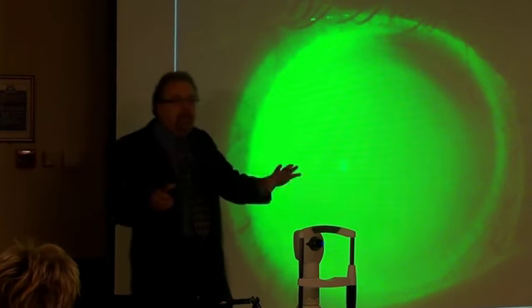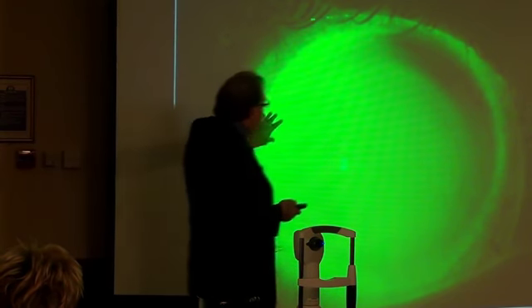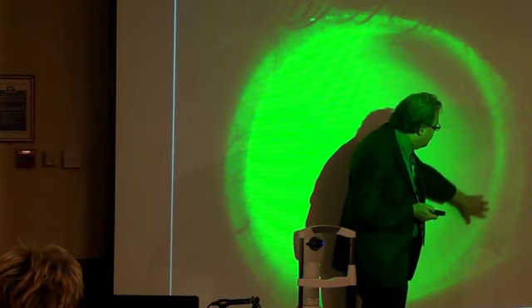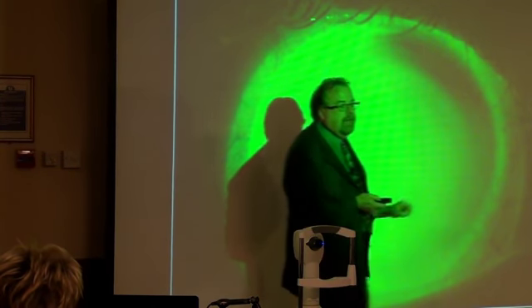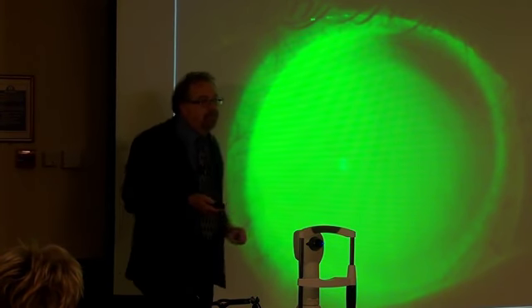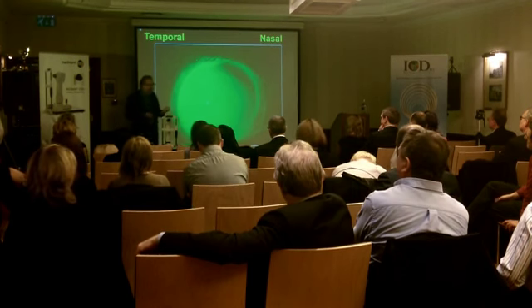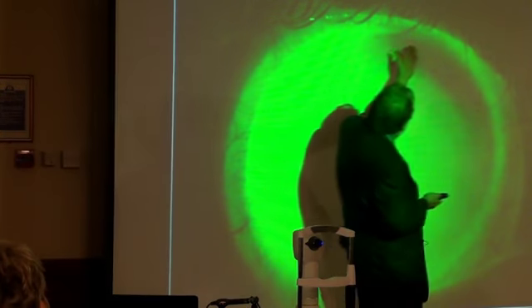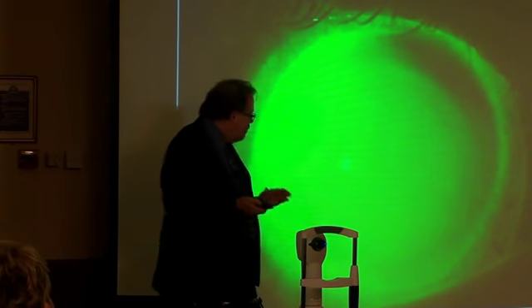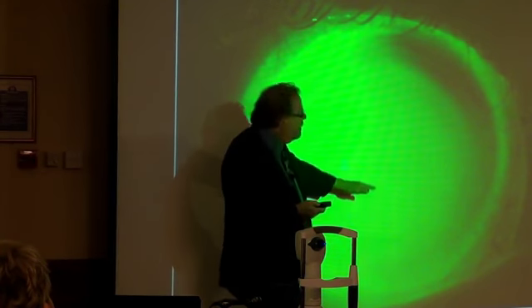Therefore, when you apply one of these scleral lenses, don't be surprised if you see a little bit of fluorescein thinning on that nasal side. It's going to look very different from what you see on the temporal side. It has to do with that height differential. You're probably wondering, why is this a little bit darker? Well, that goes away as soon as you touch the bottom of the lens and lift it up a little bit.